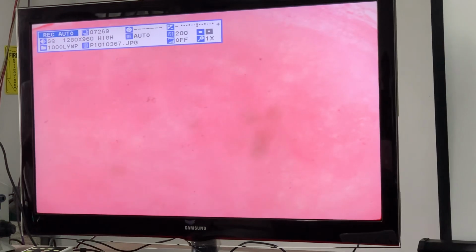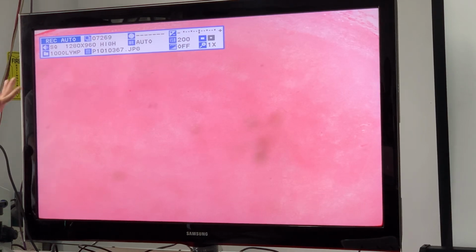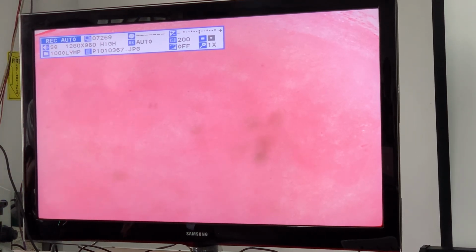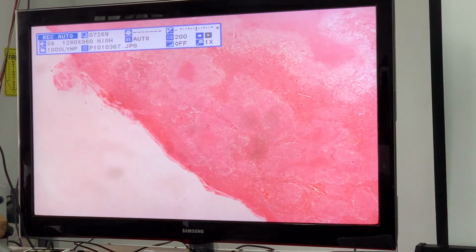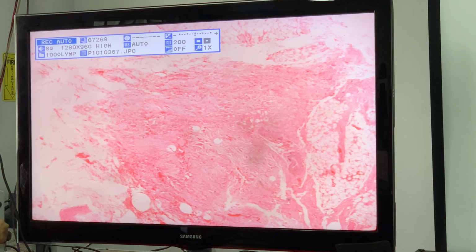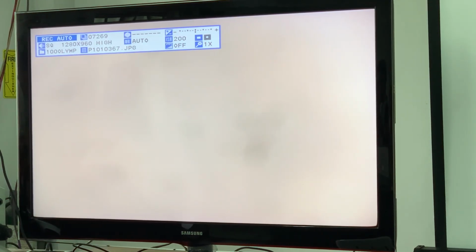All this here, this pink stuff, is just caseous necrosis. No cells, everything here is dead. So that's a very large caseous necrosis area. Yeah, I'll just go off to the side for a better one. That's caseous necrosis. Here's another one.